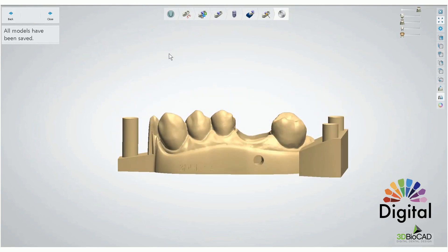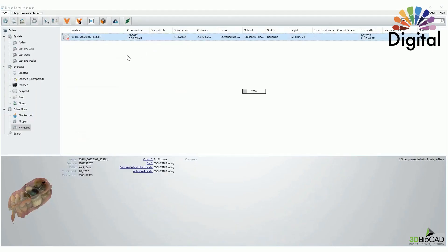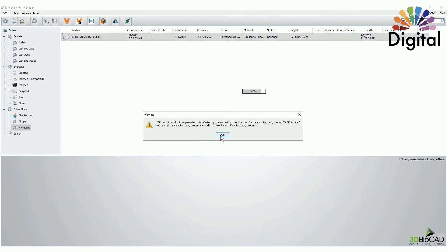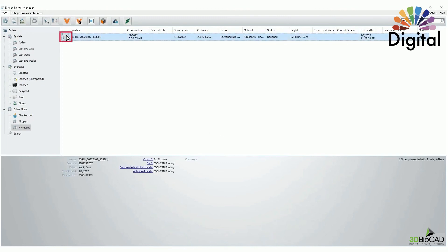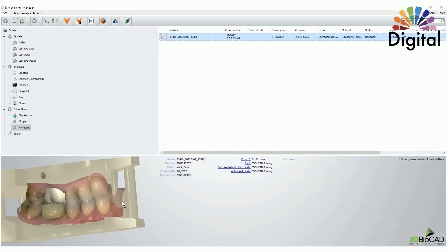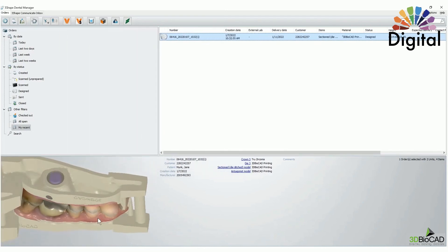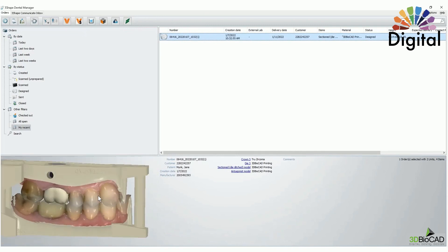Once it's all good, you have to close out. Your case status will change to 'Designed.' We can see all elements here: model, separate die, crown, upper, and lower.